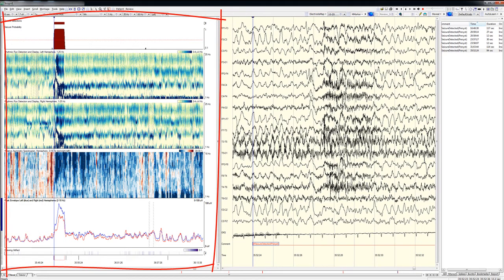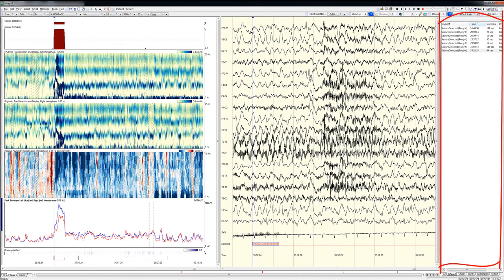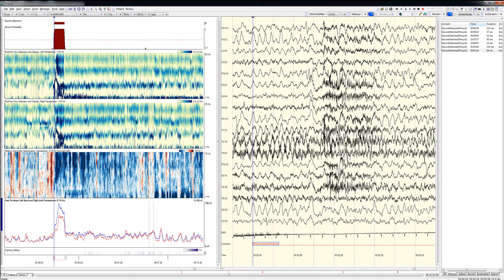and comments that were automatically generated by Persist's latest generation seizure detection algorithm. Although I won't be discussing the interpretation of the EEG trending graphs in detail, I will provide a brief overview of the graphs shown in this particular trending panel, which is one that I often used for seizure hunting.